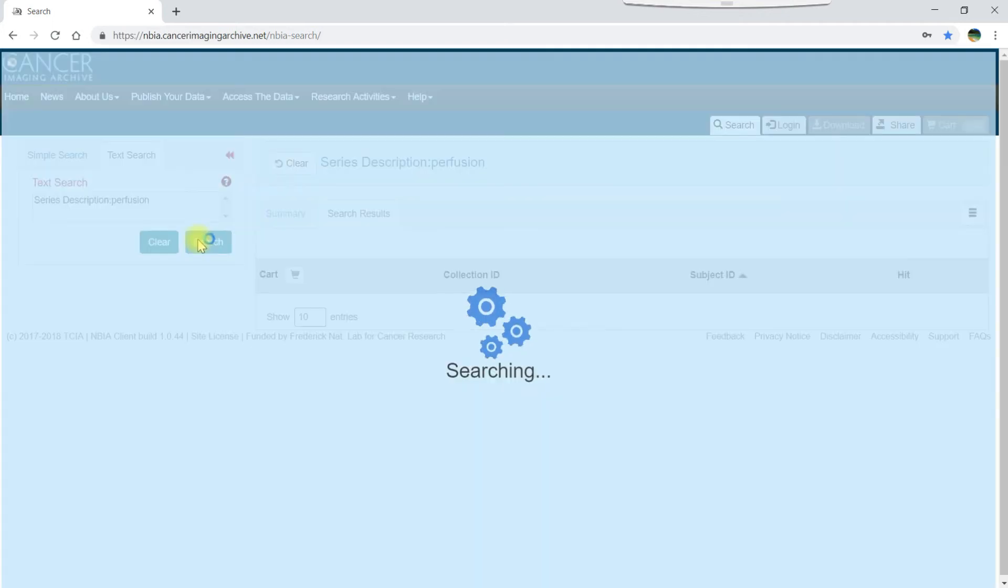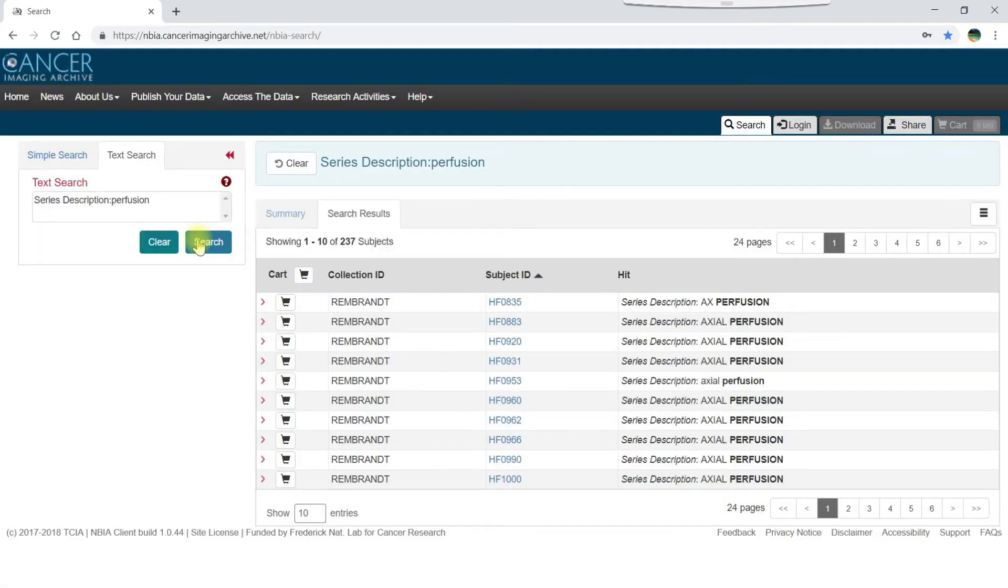Note that instead of entering the words series description, you can enter the DICOM code for series description instead. The results again show the DICOM elements that include the series description of perfusion.